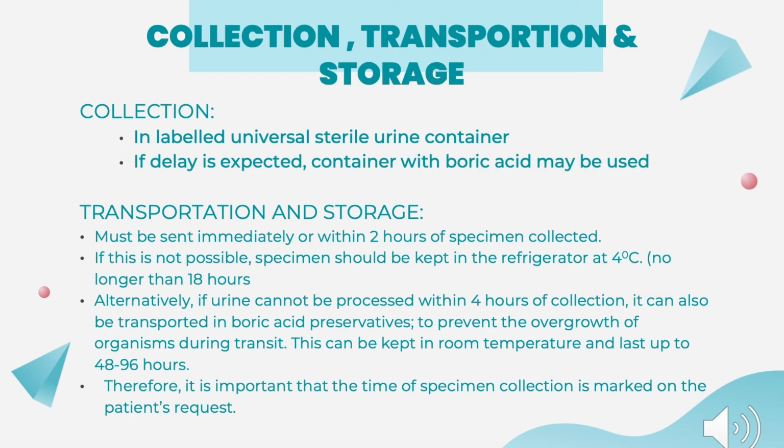Next topics are on the appropriate collection, transportation and storage. Urine is collected using a sterile container which is labeled and has to be sent immediately to the laboratory or within 2 hours of specimen collection. If this is not possible, sample has to be kept in refrigerator at 4 degrees Celsius.